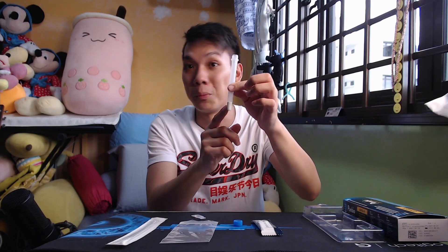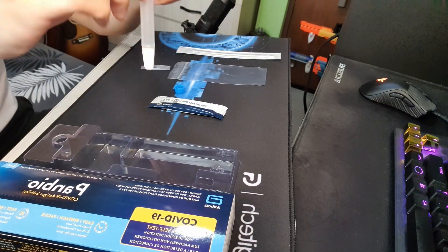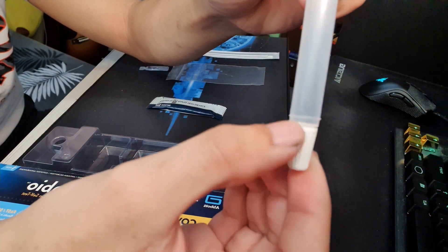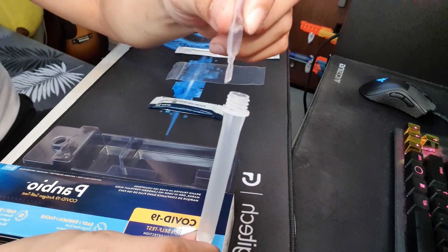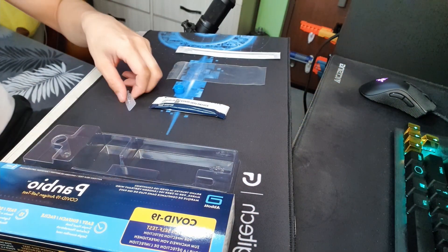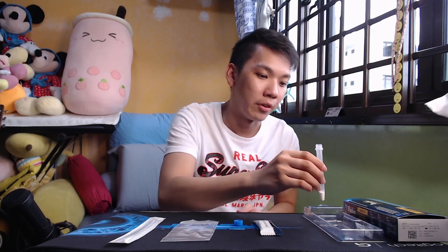Step two: squeeze the contents of the liquid into your test tube. You may need to squeeze the buffer bottle two to three times to make sure the liquid is inside. You should see a fill line on the test tube — make sure the liquid is at or past the fill line. That is very important. Once there is liquid inside, you can set it aside and leave it for now.